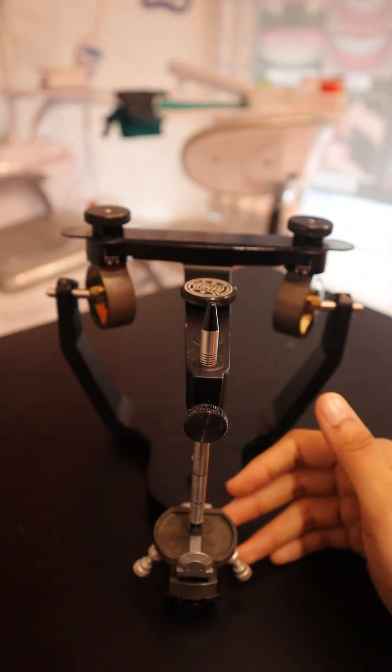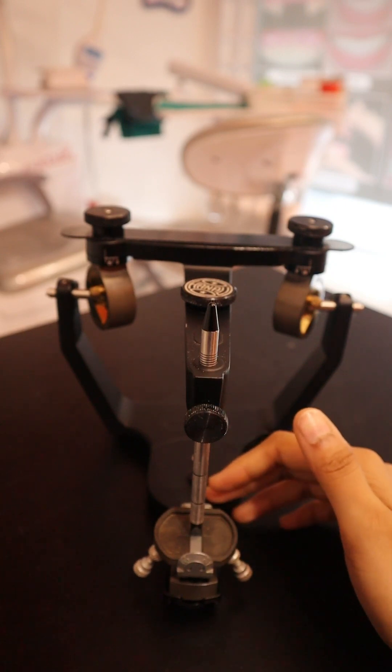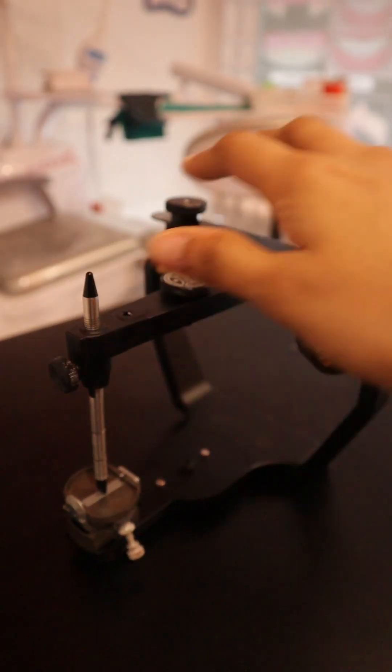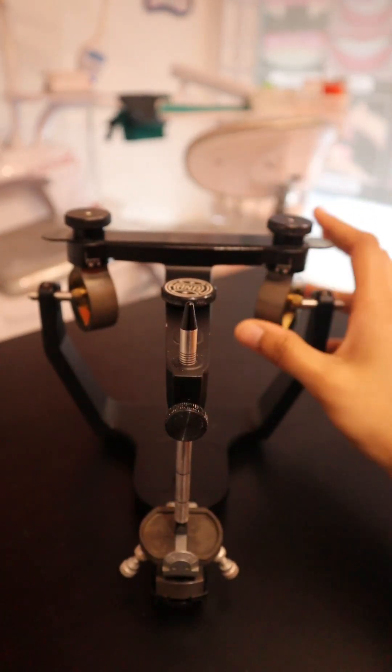It basically represents the patient's glenoid fossa and the portion of the cranium as the upper articulator member. The lower member functions as the condyle of the patient's mandible. Now let's go on to the basic parts of all the articulators.